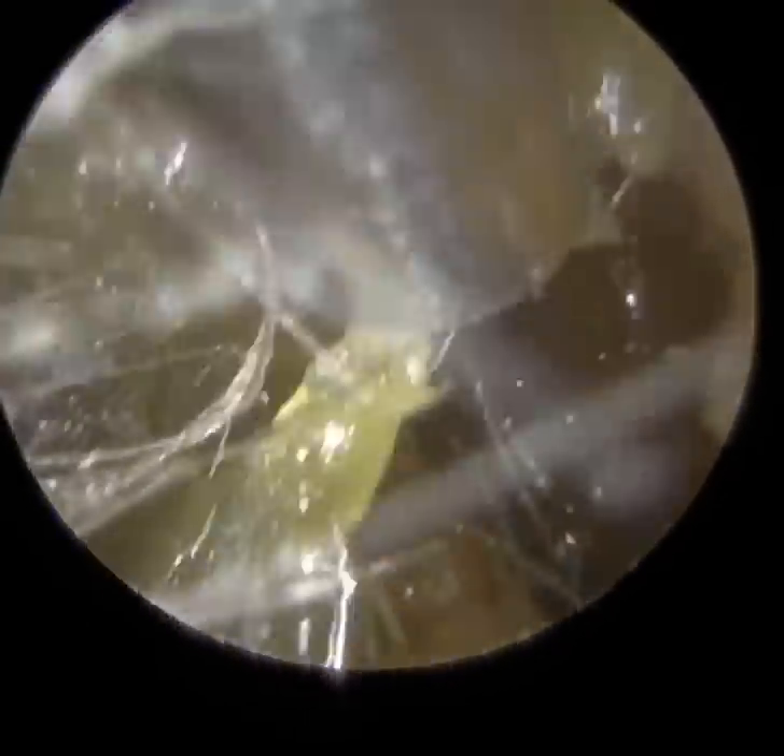We're now going to show you the same patient's right ear. Again, a lot of wax and keratin, still quite stubborn. Now this eardrum is also retracted, but it's nowhere near as retracted as the left ear. It's just the attic region that's retracted, and you'll see that in a minute. Again, they've got a blocked eustachian tube — it's a long-standing issue for this patient.